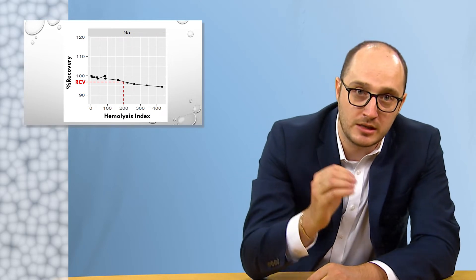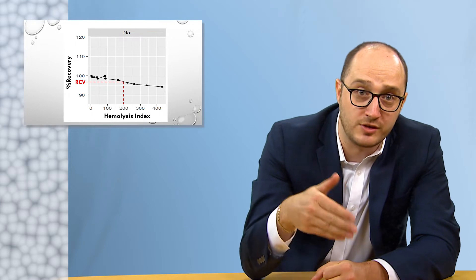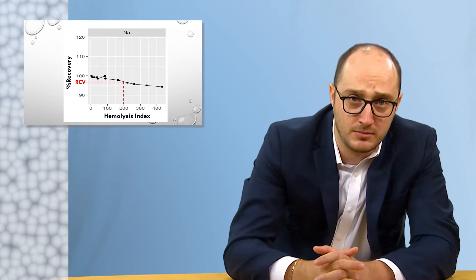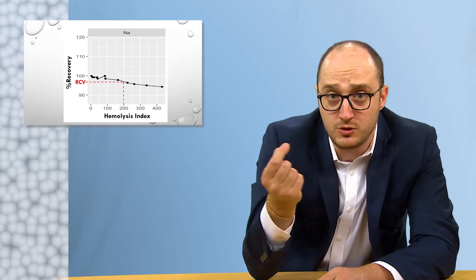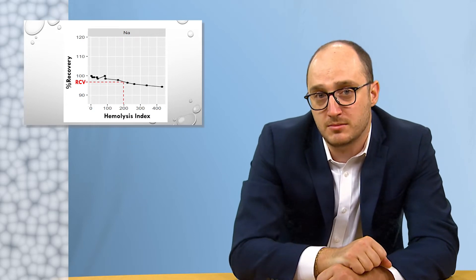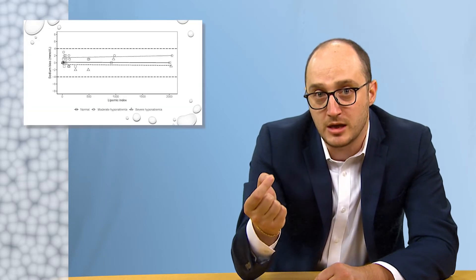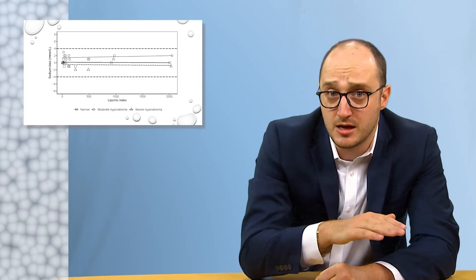For lipemia, our recently published data also shows that current product inserts are overstating the tolerance for interference because they define their lipemia thresholds by performing spiking experiments using intralipid — a soybean oil, egg yolk phospholipids, glycerin, and water emulsion — instead of using human samples containing high levels of endogenous lipids. We recreated the experiments vendors typically perform with intralipid using three different concentrations of plasma sodium and saw no effect up to the highest L-index tested, which is 2,000 on Roche. And then we evaluated human samples with endogenous lipemia by direct and indirect methods and saw a significant difference when the lipemia index exceeded around 700. Not a single sample with L-index over a thousand was within plus or minus 4 millimoles per liter.